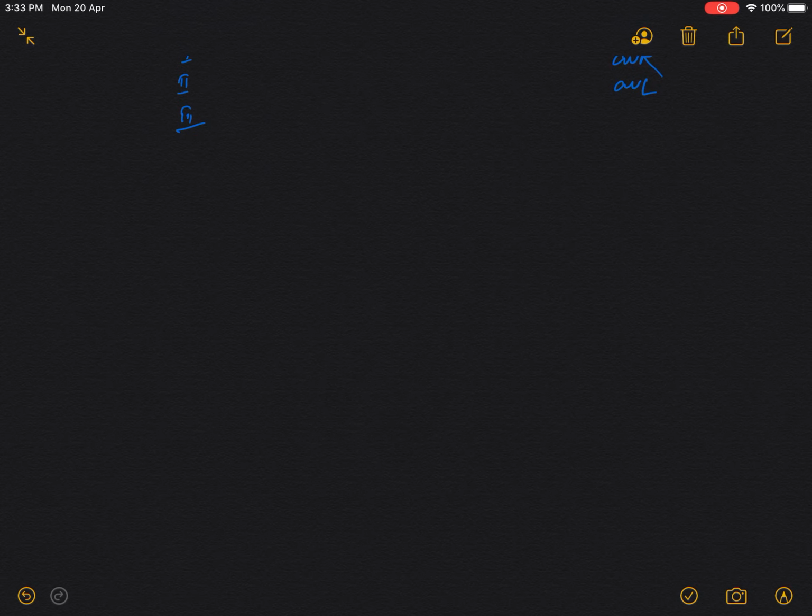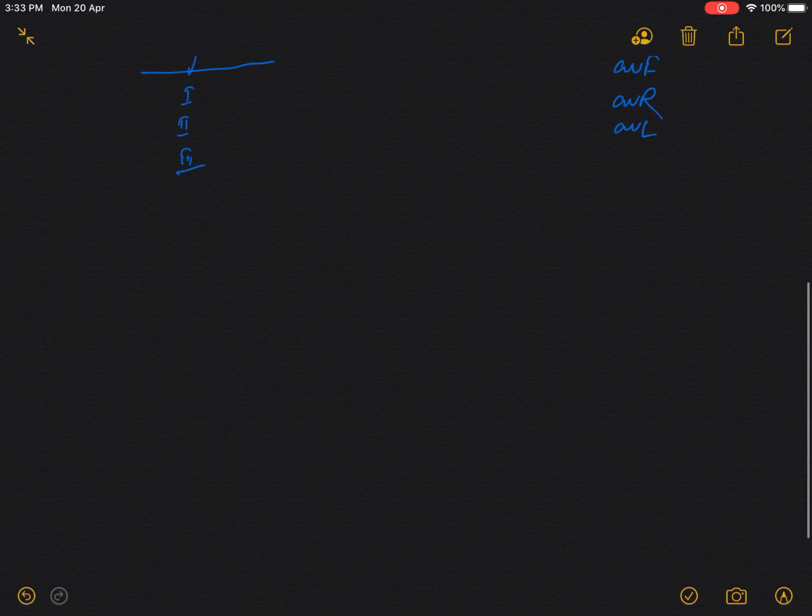The bipolar lead measures the electrical difference between two points, or between two limbs.